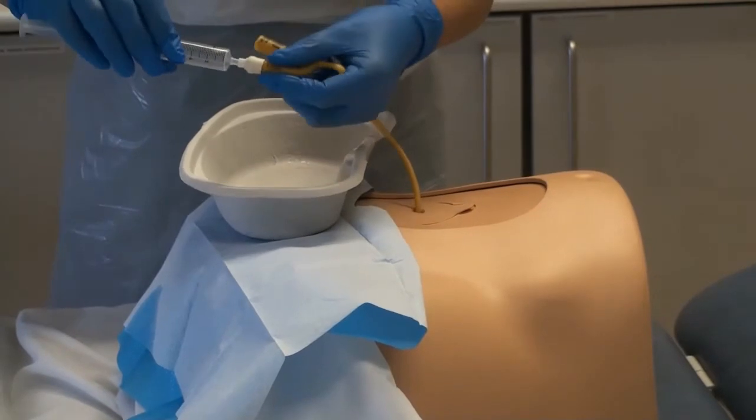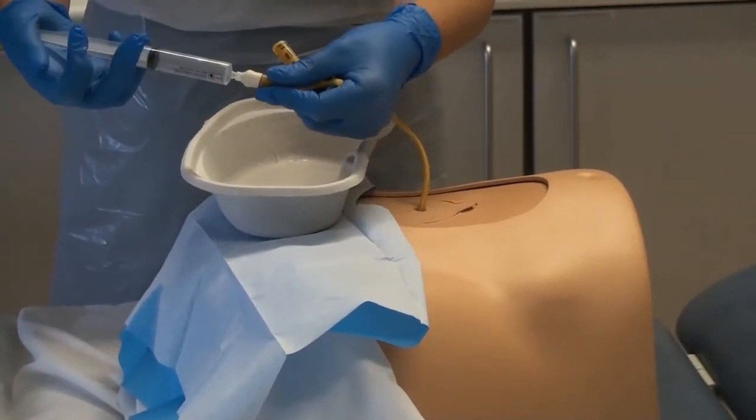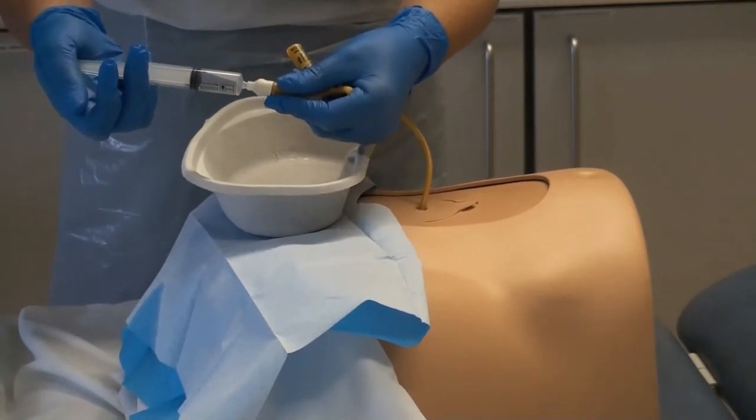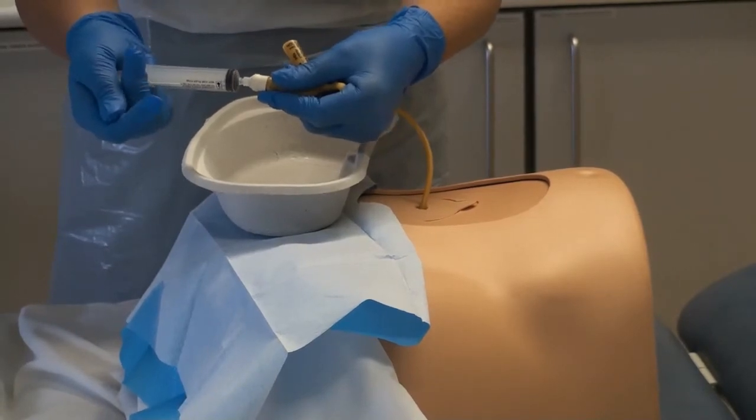Observe for the drainage of urine; you may apply gentle abdominal pressure if needed. Inflate the balloon according to the manufacturer's directions and observe for any resistance.